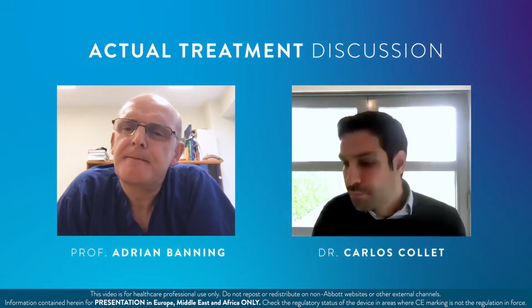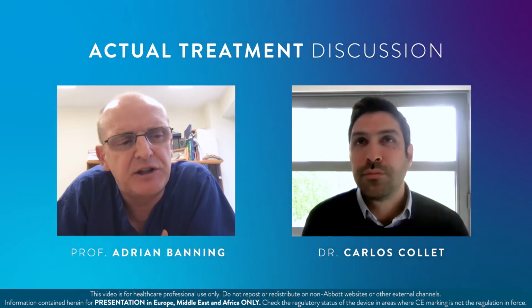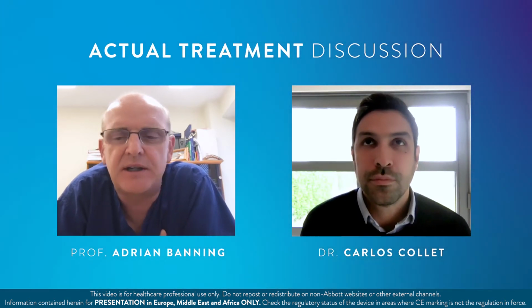That's a great case. And I think one of the things in intervention that we love, of course, is that there are guidelines where we must do stuff, or at least we feel very strongly that this is the way to do stuff. And then there are lots of elements where our practice is more of an art than a science. And I guess what interested me was that you chose to be quite aggressive with the main branch before trying to wire the side branch. Were you surprised then? What do you think the mechanism was? Why was it so difficult to wire the side branch when, on the OCT originally, we thought the side branch looked as if you could see down there? Did that surprise you? Did you feel that you were behind something?